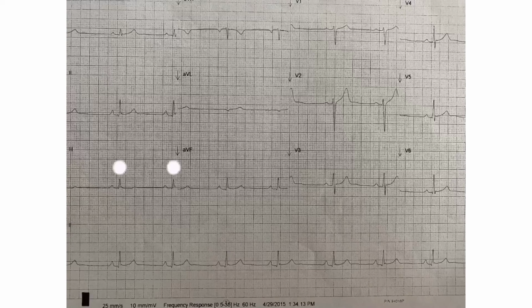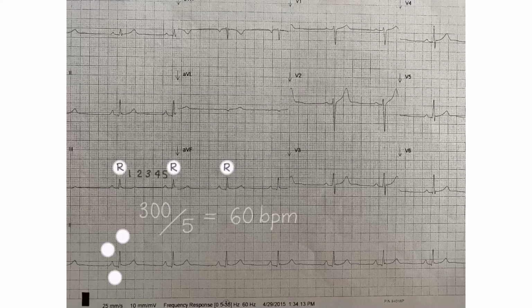Looking at a real live EKG, I'm going to label here the R waves. And we can measure the patient's heart rate by counting the boxes. If there's 5 boxes in between, that means the heart rate is 60 beats per minute. We can also label the different sections of the EKG. So again, if you think of the letters, it's P, Q, R, S, and T. And then we can look at the regularity of the heart rhythm by looking at the distance between the R waves, which in this case looks really good. Again, notice sometimes the R wave is upside down. That depends on the configuration. Overall, this patient looks pretty healthy.